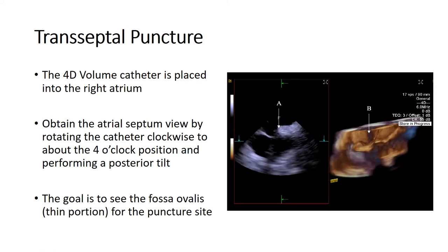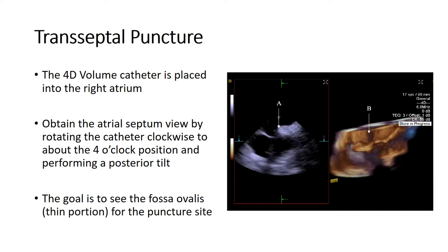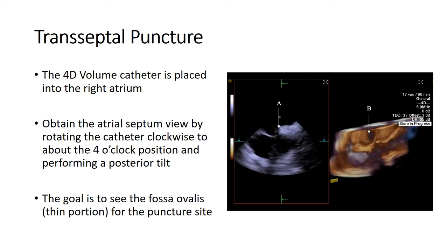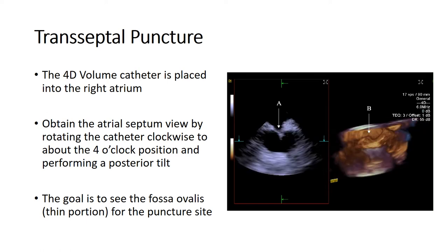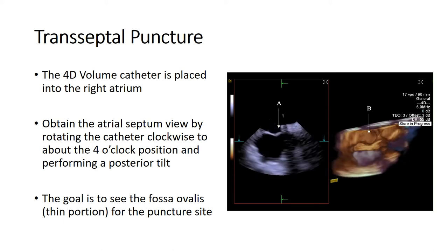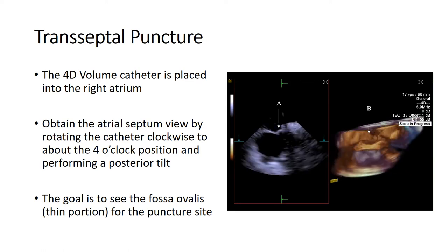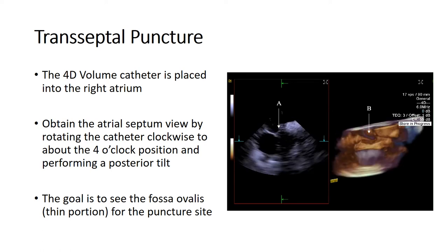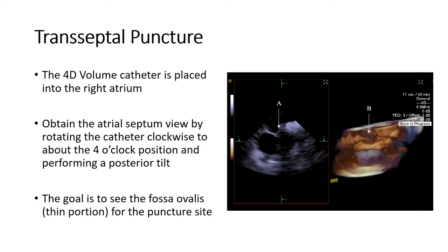The left atrial appendage closure procedure begins with a transseptal puncture, positioning the 4D volume ICE catheter in the right atrium. You then obtain the interatrial septal view in search for the fossa ovalis by rotating the catheter clockwise to about the four o'clock position and performing a slight posterior tilt. You can see a side-by-side 2D and 3D view of the interatrial septum to find the best location for the transseptal puncture. It is important to note that the Watchman procedure can be done with the imaging catheter from the right or left side; however, ICE imaging is optimal from the left side.